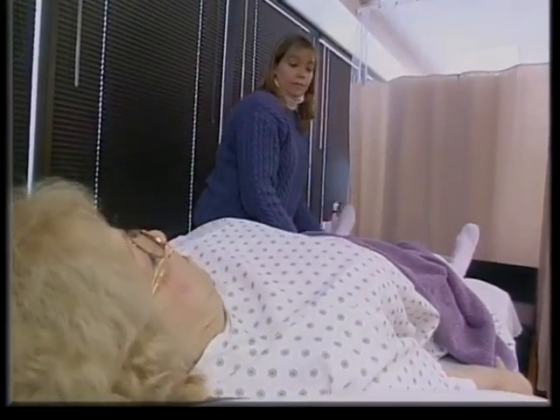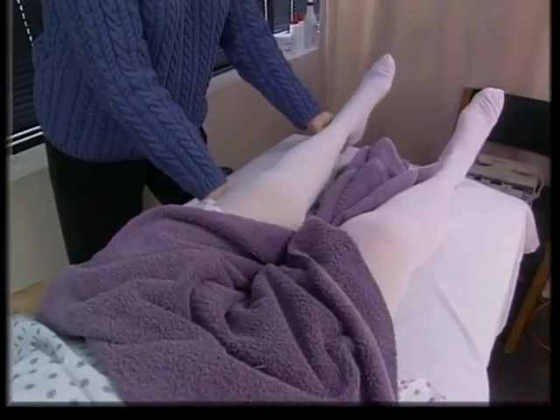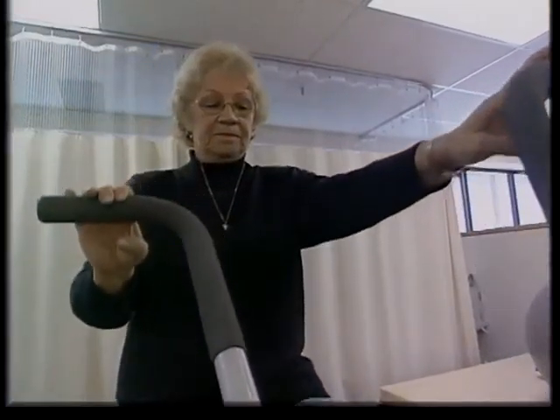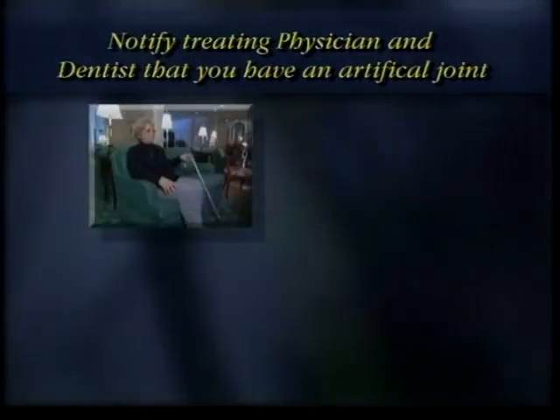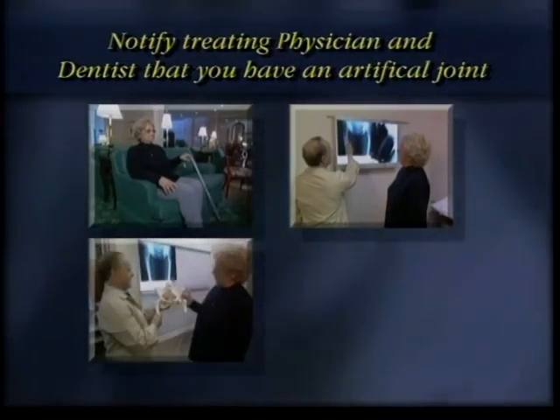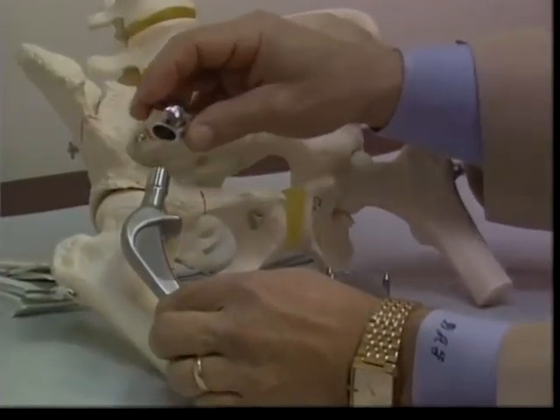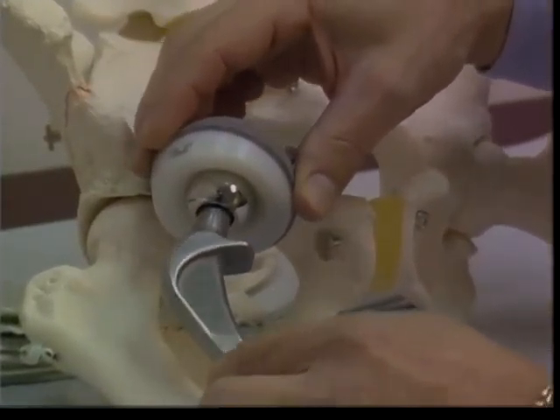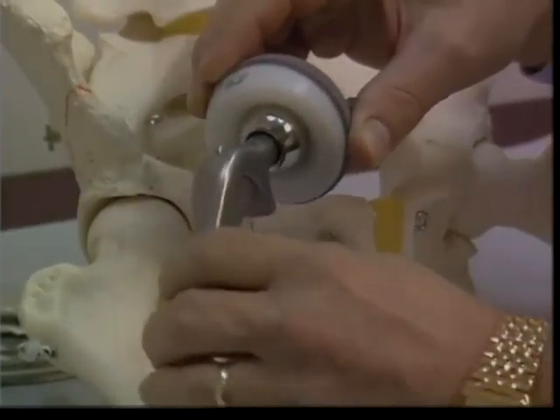Major surgery like hip joint replacement requires a period of adjustment. Take it easy during this time, trying to focus on the healing process and on gradual, practical improvements to your general condition. People who have joint replacement surgery of any kind must be particularly cautious about infection. It is necessary, for example, to always tell your dentist or physician that you have an artificial joint. Having a large metal implant in your hip may sometimes set off metal detectors in an airport or at a public event. Your doctor can provide you with a card identifying you as a patient with an artificial implant.